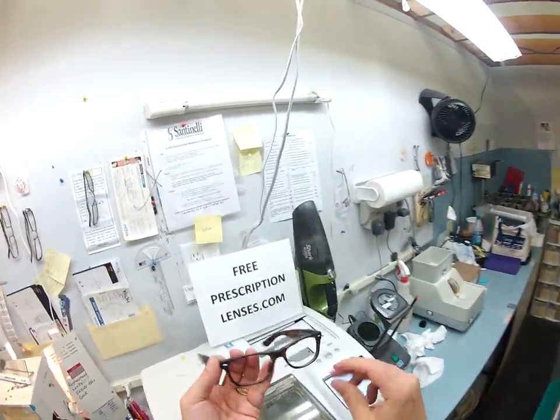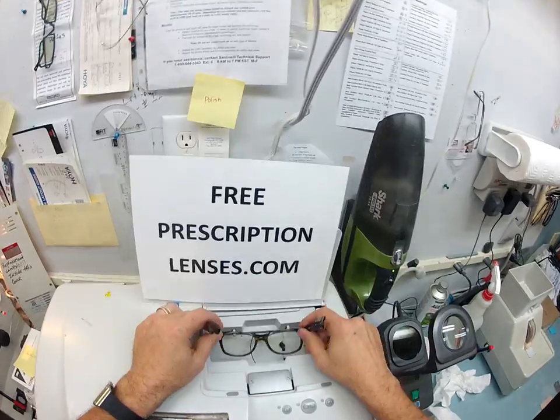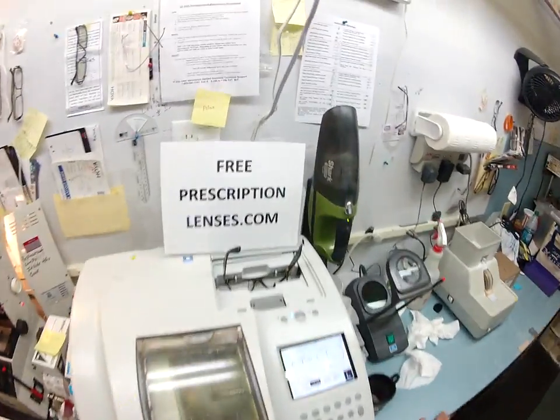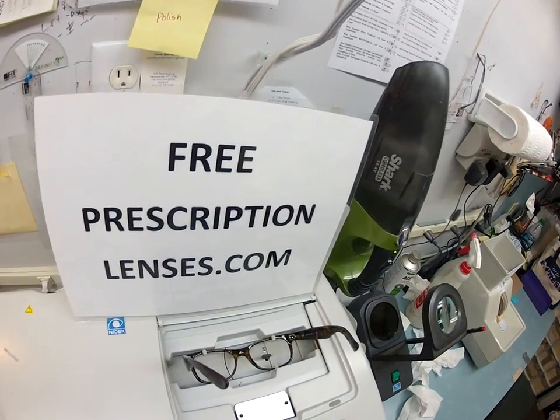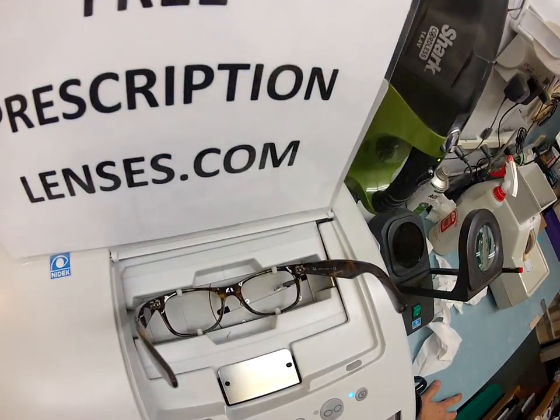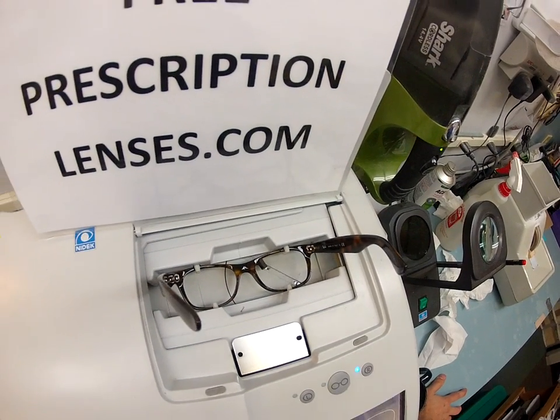I'm going to take out the original G15 lenses and put your Italian frame into my Italian Santinelli LE1000 patternless edger. Here at FreePrescriptionLenses.com, where everybody loves a bargain and no one is disappointed with quality.